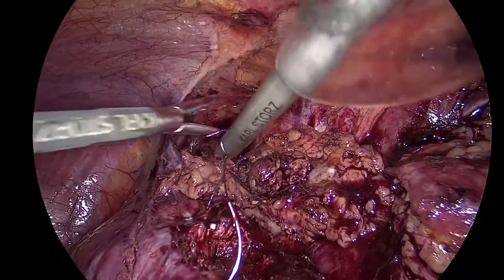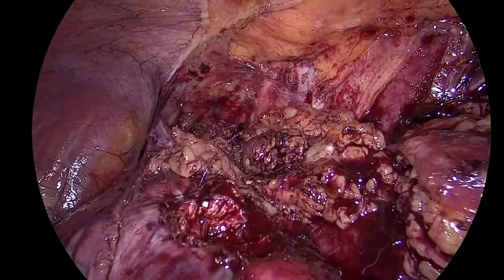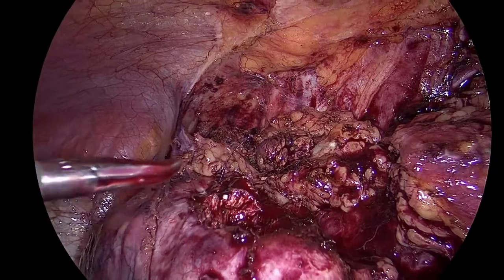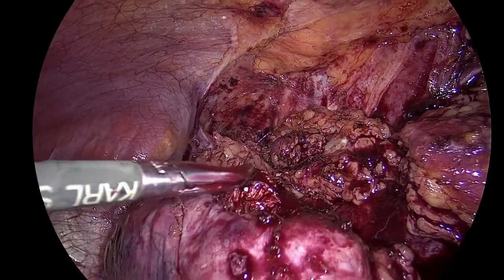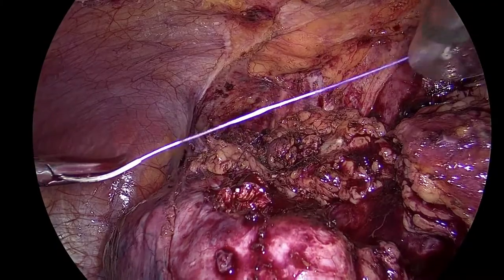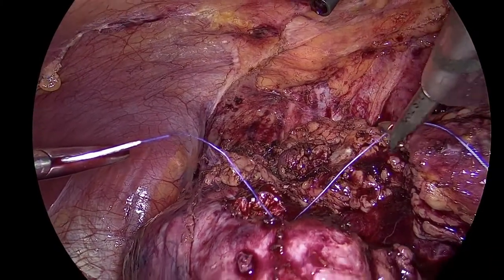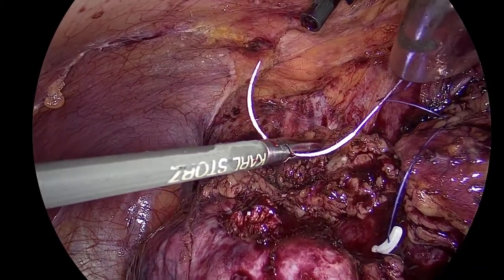You see how the mobilization of the whole system is very important. Clearly, in any doubt of your positive margins, you need to go further in. Now, it would have been stupid for me to do the further dissection without clamping. It would have been a mess, because the less bleeding comes from the enucleation part of the procedure. You have less bleeding in enucleation, this is clear.